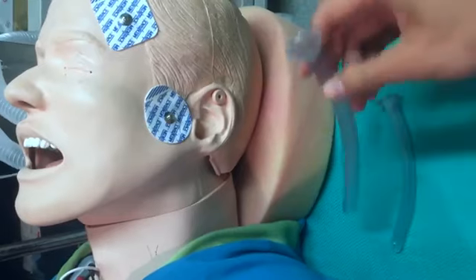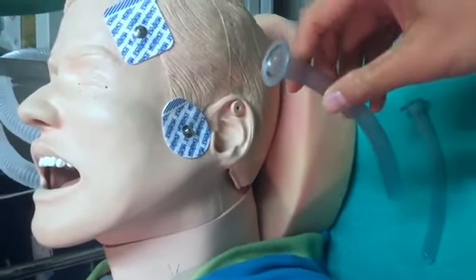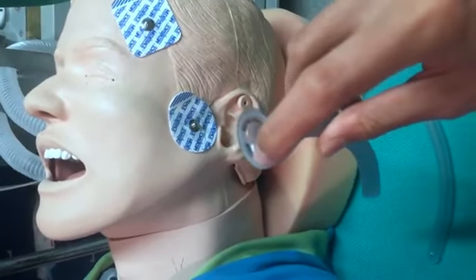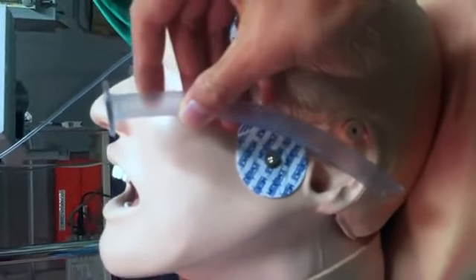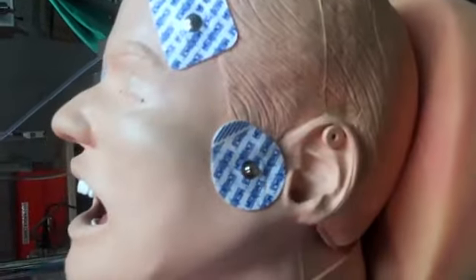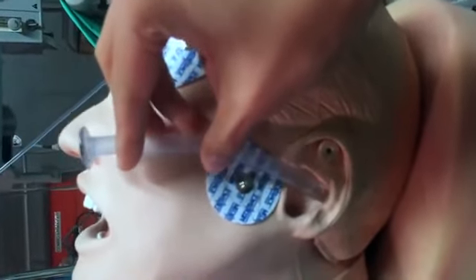So the best way to put this in a patient, you want to measure it first. This is the flange, this part. You want to put it on the outer border of the nare, and then the tip, this part, should reach but not exceed the external auditory meatus. As you can see, I am definitely going past that, so I would try maybe a smaller one. We'll see. Oh, this is perfect.